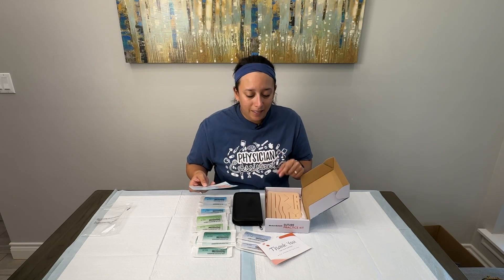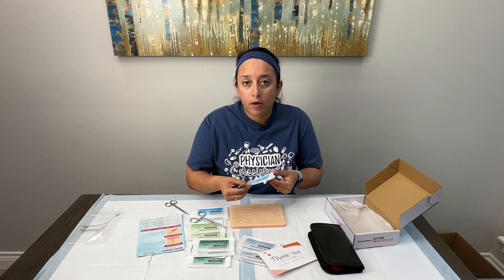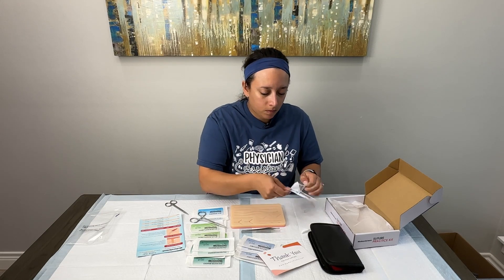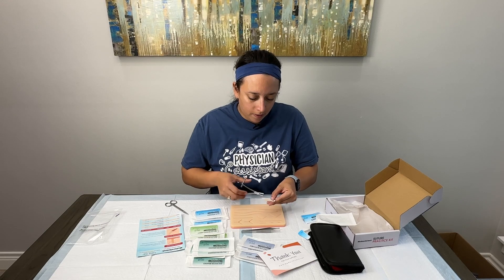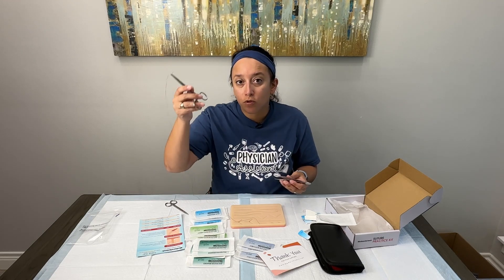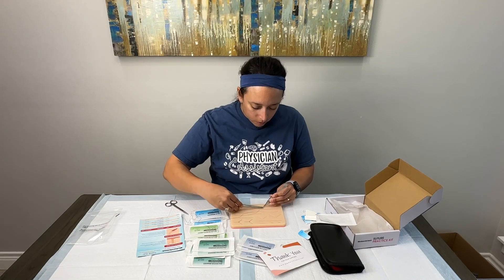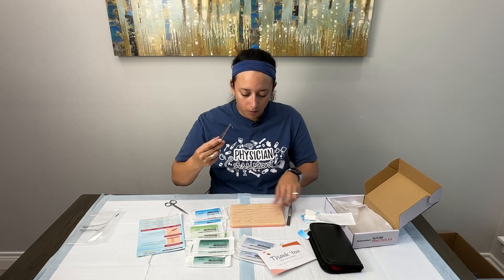In just a second we'll go ahead and run a stitch through here just to see how it behaves with our tools. We're going to open up one of the silk braided 4-0s to do a test drive of the silicone mat. The needle drivers are small but they're pretty much the size you would get in the disposable suture kits in the emergency department, so I like that they're true to size.